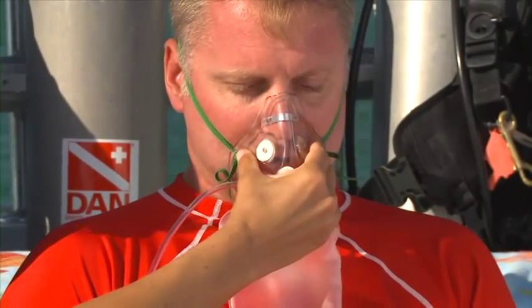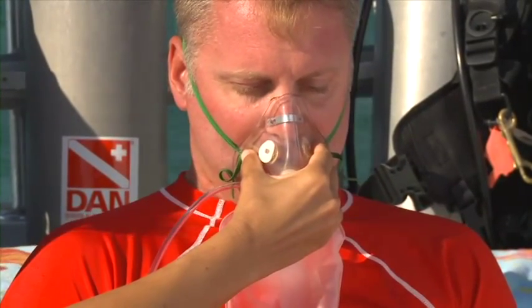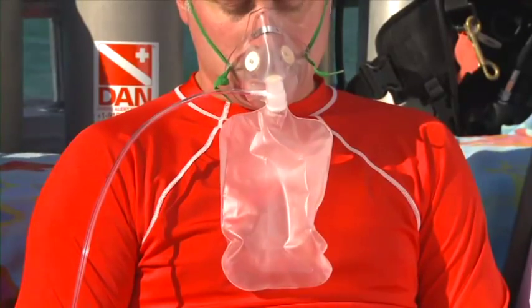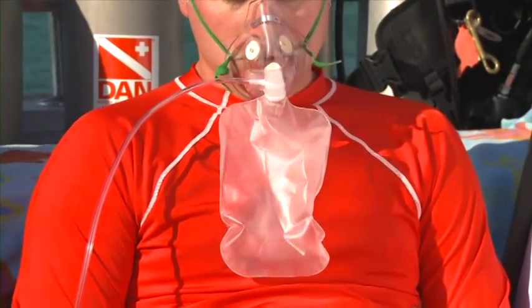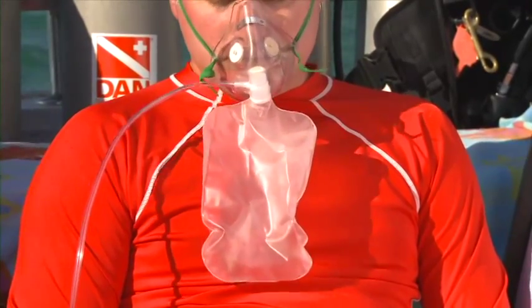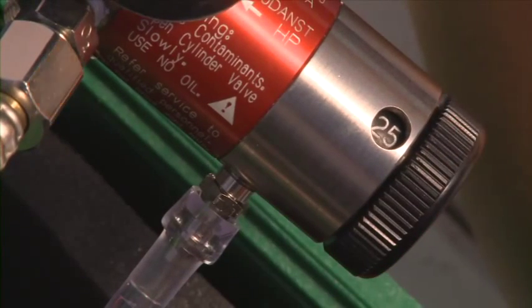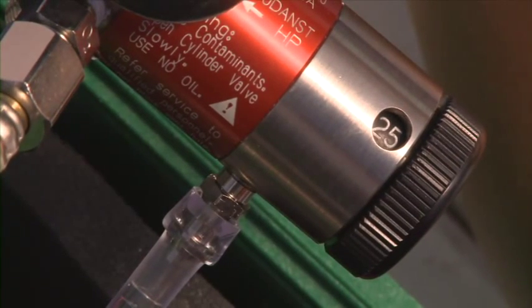If there are leaks, you may need to gently hold the mask in place to improve the seal. Instruct the diver to breathe normally and watch for signs of breathing. Assure that the reservoir bag remains inflated. If not, increase the constant flow rate to 15, 20, or 25 liters per minute as appropriate.